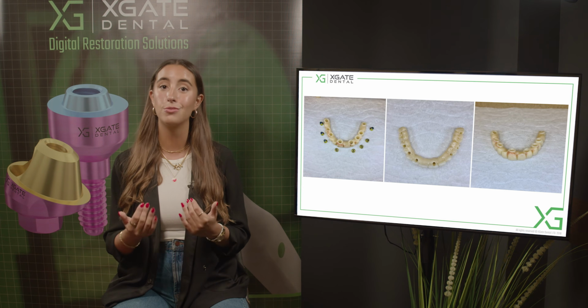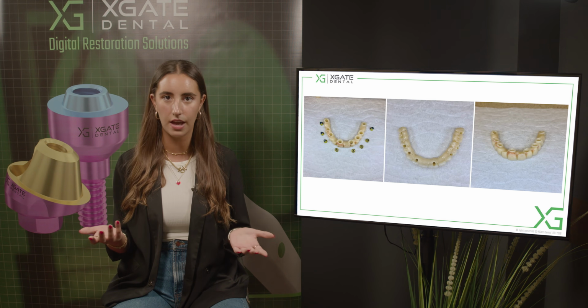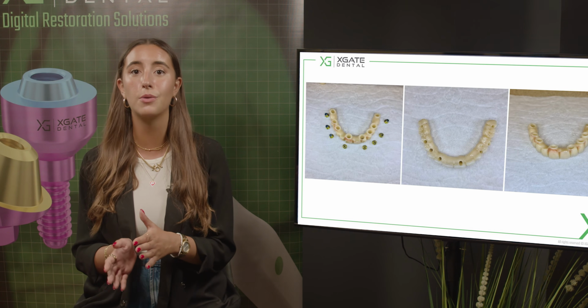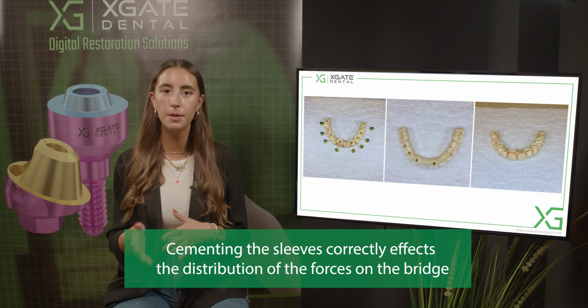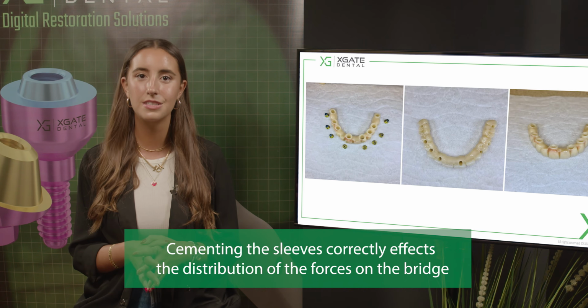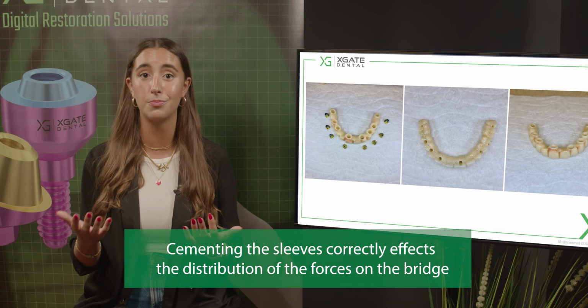If you cement them outside the mouth, all the inaccuracies will be the same and they'll stay. And then when you assemble the bridge on top of the implants, you have those forces that will be applied on the implants or on the screw or on the multi-units. Then there's less chance for problems with the implants, less chance for the zirconia to break. From our experience, this is probably the only way to have a full monolithical zirconia bridge that doesn't break down.